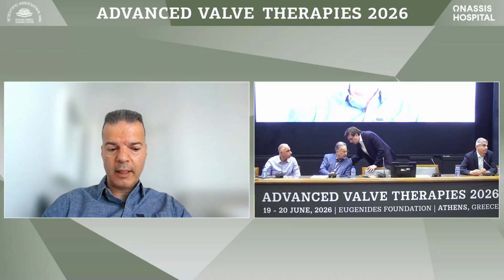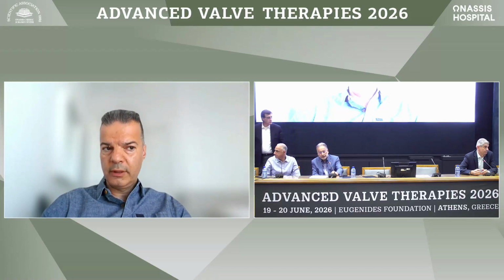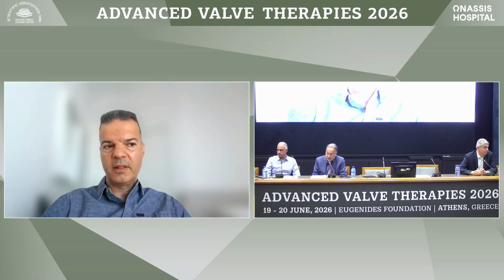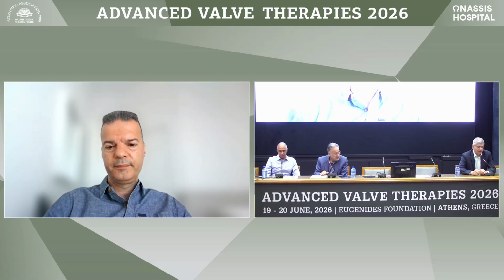However, we have to take into account the fact that the patients are sedated. And what you get acutely on the table with TEE, you may get disappointed the following day when the patient is awake. You may find out new jets coming from the posterior area that you didn't account for. And it is really disappointing to put one or two clips anteroseptal and having avoided to put a posteroseptal device that you might have had a better result. But of course, I share these concerns.